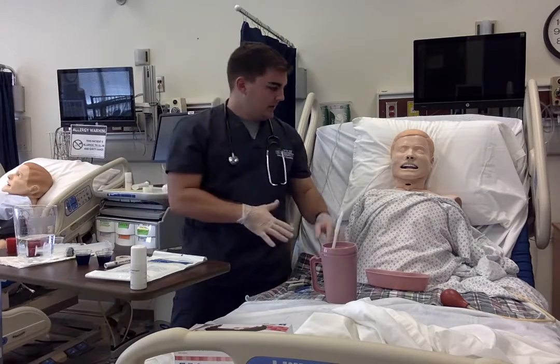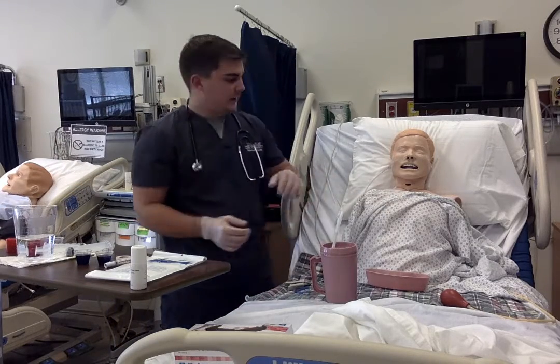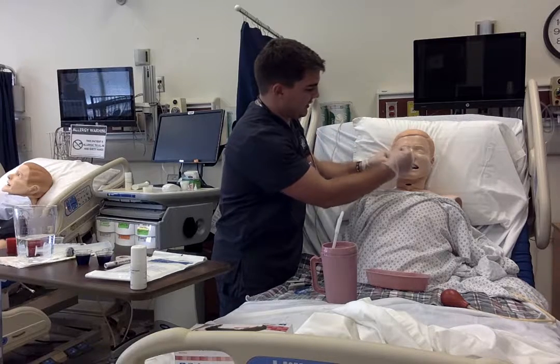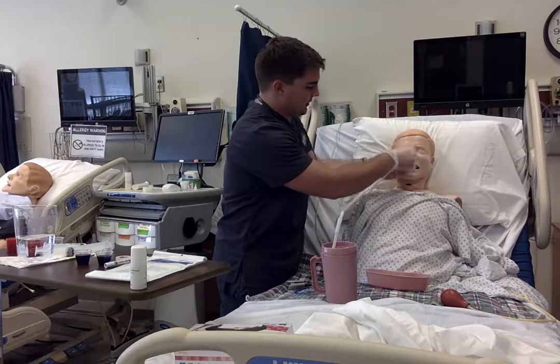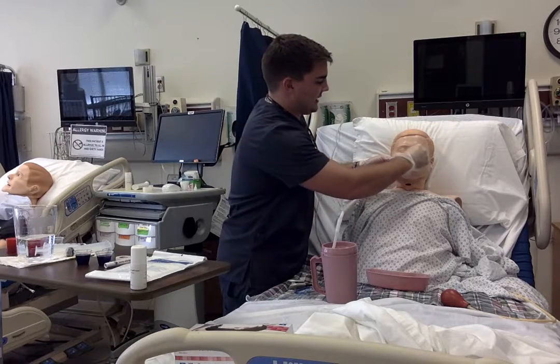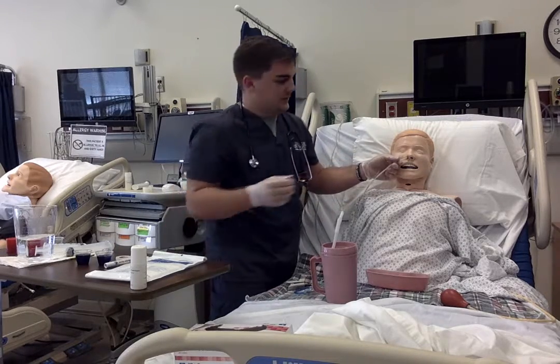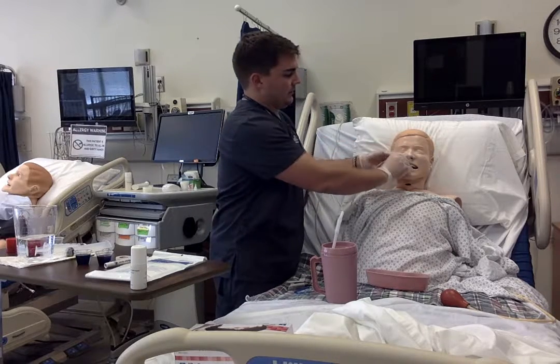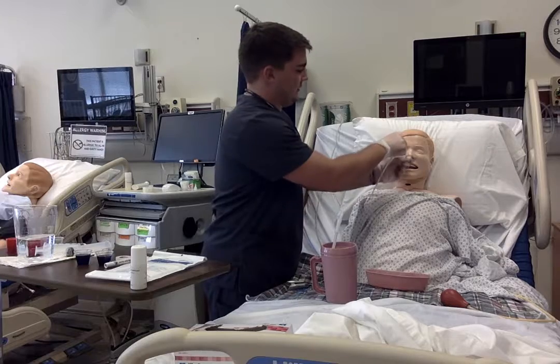Now that I know the tube is in the proper placement, I can tape the tubing to the patient's nares, going under and then over on the opposite side, as well as doing the same on the other nostril, going over and under.